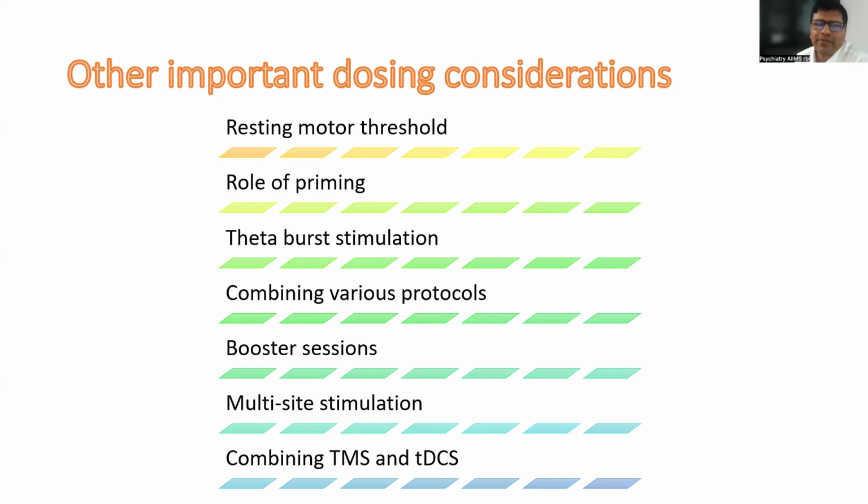When identifying the resting motor threshold, we give 10 stimuli to a given area, particularly the motor area, and we look for contractions in the hand area, either through EMG or through visual contractions. If you get 5 effective contractions, or 5 deflections in the EMG with an amplitude of more than 50 microvolts, we call them effective contractions. At least 50% of the stimuli need to be responded to by the neurons.